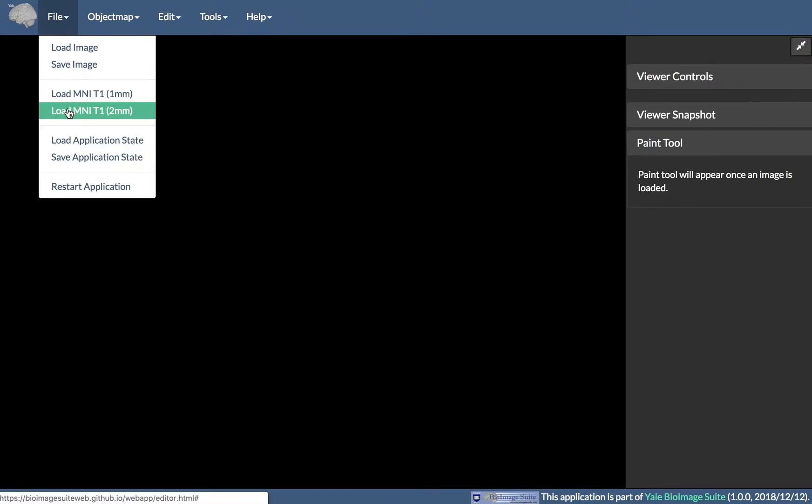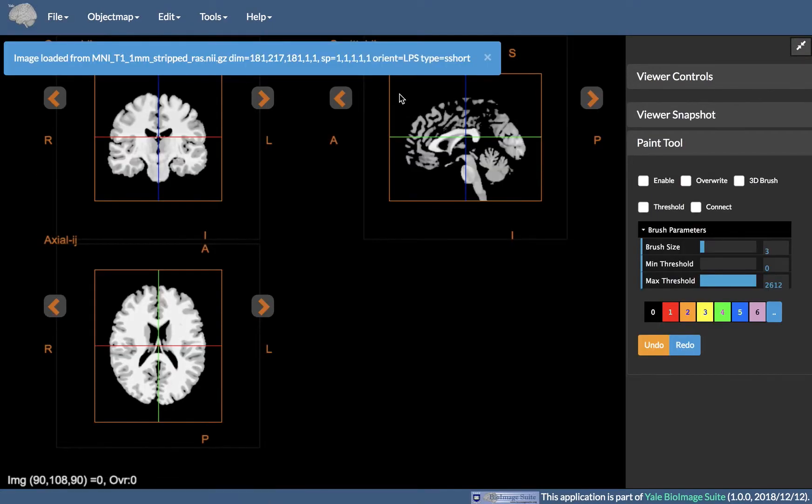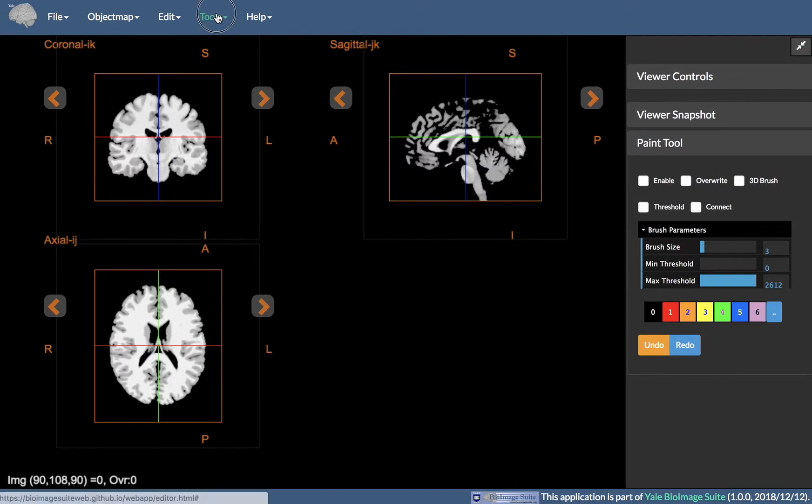This video will show you how to use the Landmark Editor in BioImage Suite. The Landmark Editor provides functionality for manually identifying and localizing landmarks of interest within the imaging data.